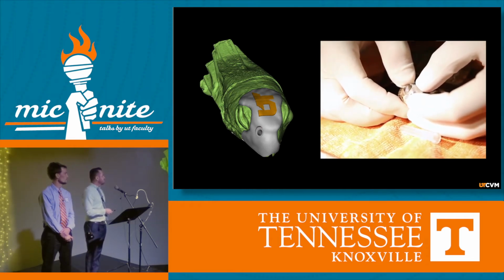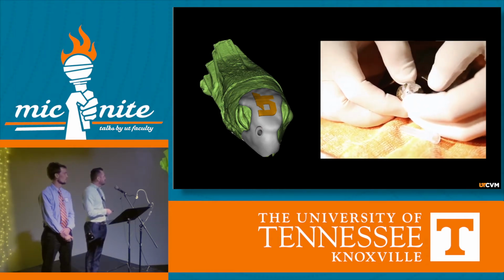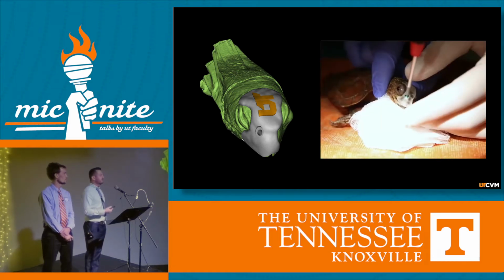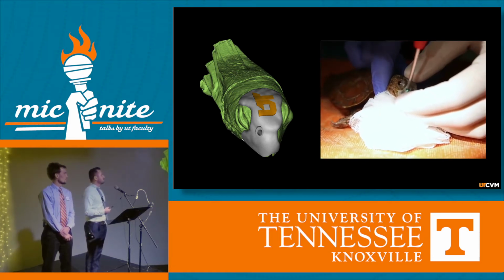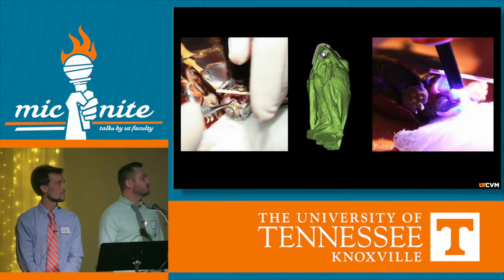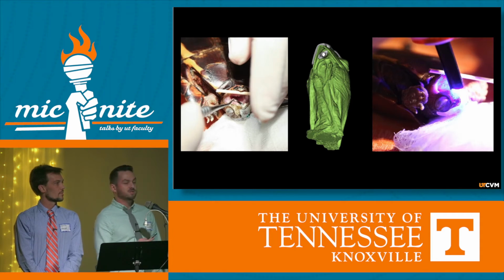So here's Patches with his second mask, and the big difference is now we have this little threaded, recessed hole. What we're going to put in there is actually a titanium screw. That screw is kind of crucial because what we're going to do is build a little resin tooth over top of the thread. So here we're just packing in layer by layer a little dental resin, and on the right side, what we're doing is just hardening that in layers.